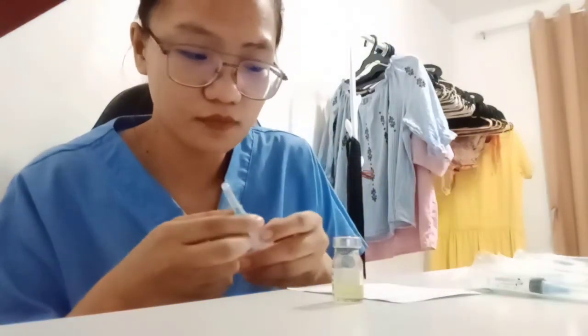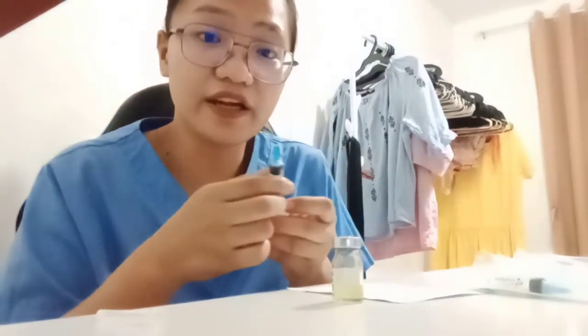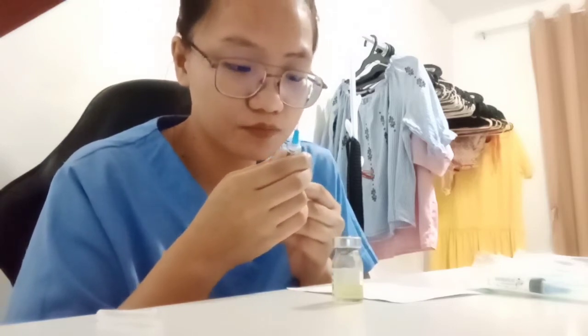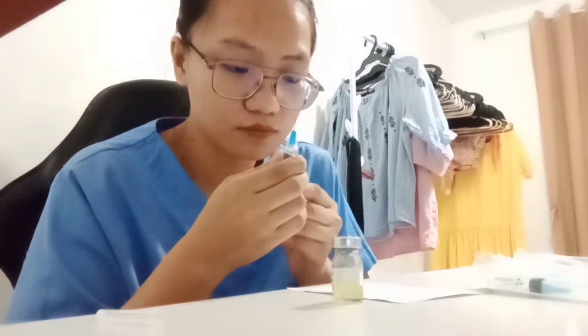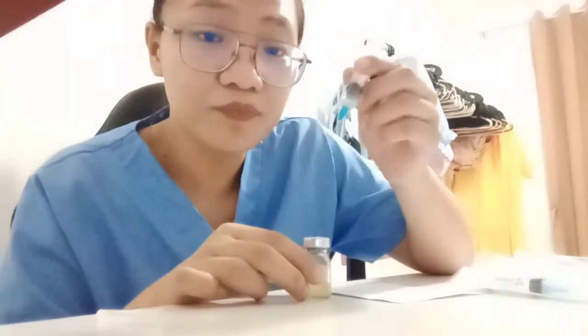Ensure that the needle is firmly connected to the syringe. Next is to remove the cap and draw air equal to the amount of medication. Next is to carefully insert the needle into the rubber cap so that it will remain sterile.